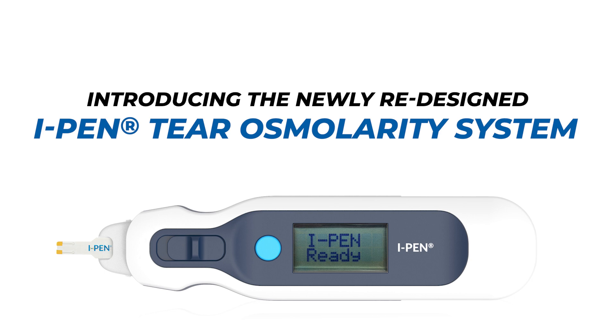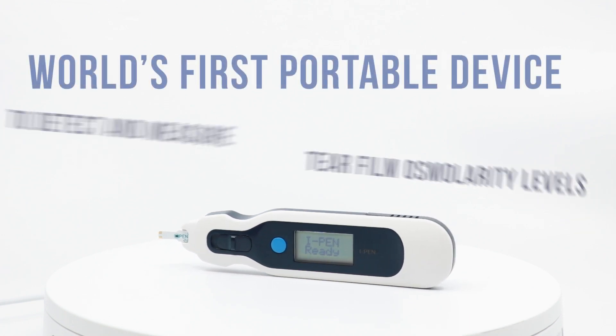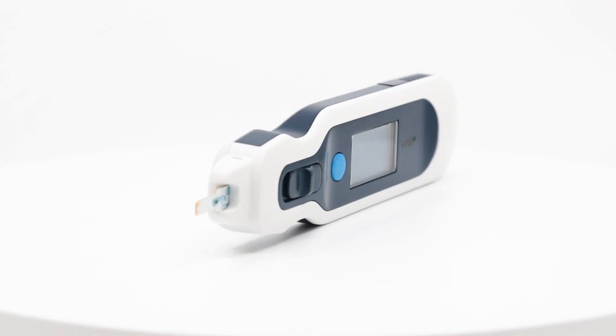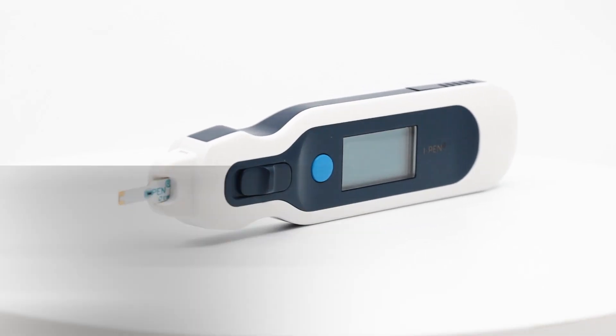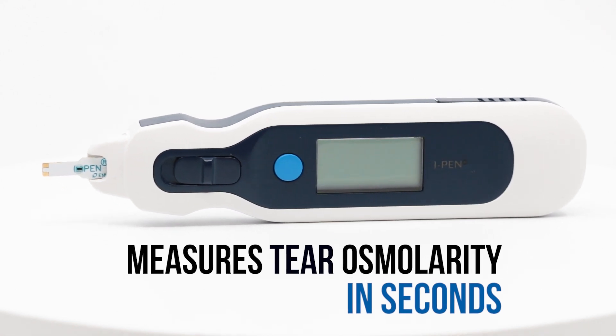Introducing the newly redesigned eye pen tear osmolarity device from iMed Pharma. The eye pen measures the tear film osmolarity levels associated with dry eye disease. Using state-of-the-art technology, the eye pen provides a quick and accurate quantitative measurement of osmolarity by analyzing the tear-soaked tissues in contact with the tear film.